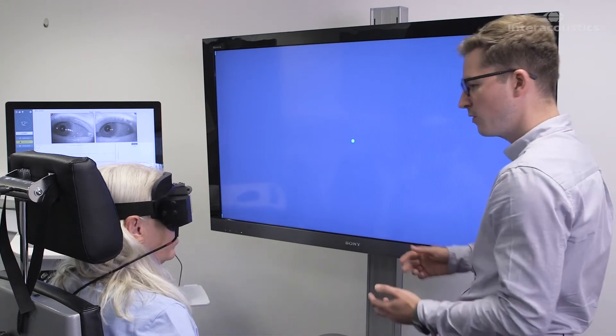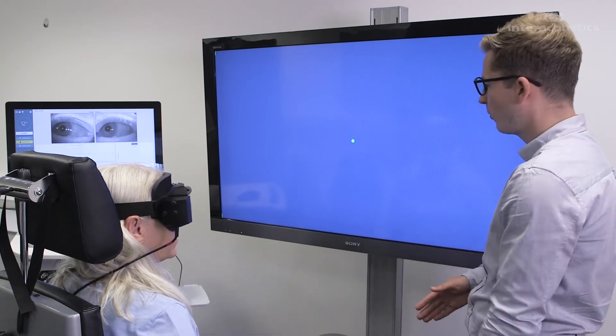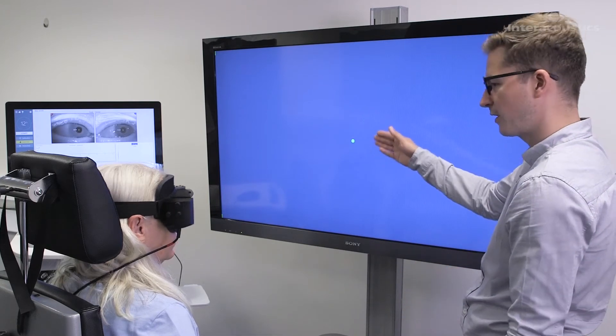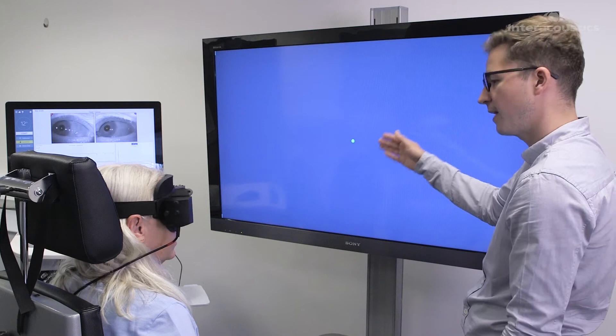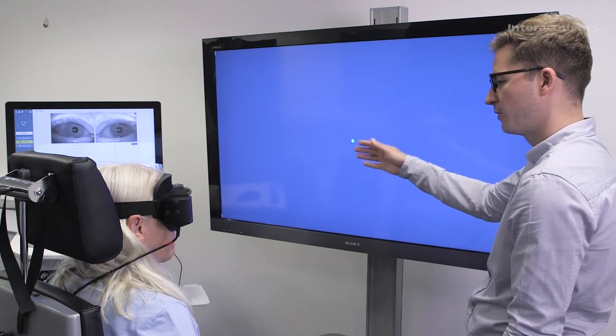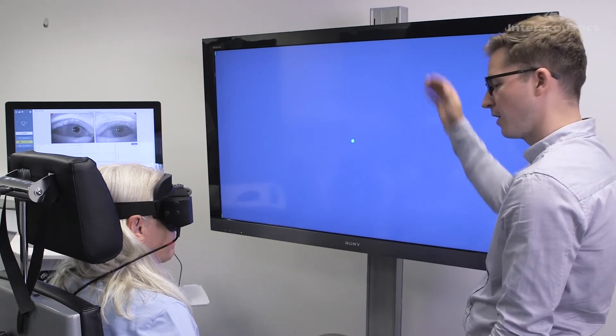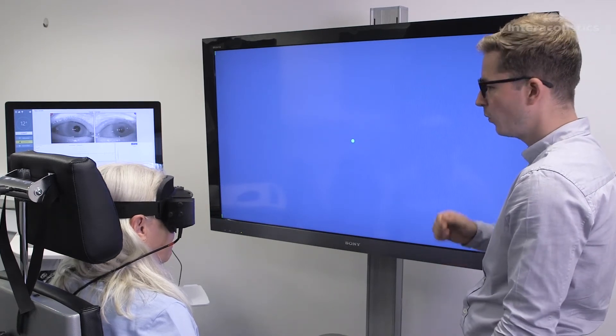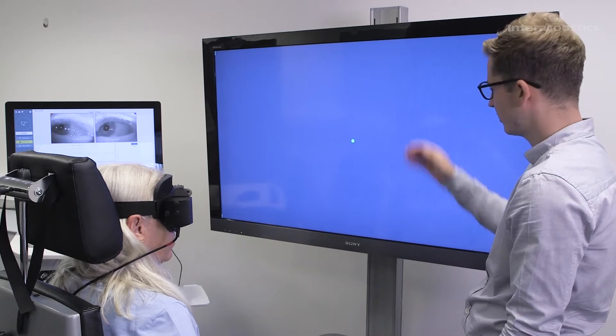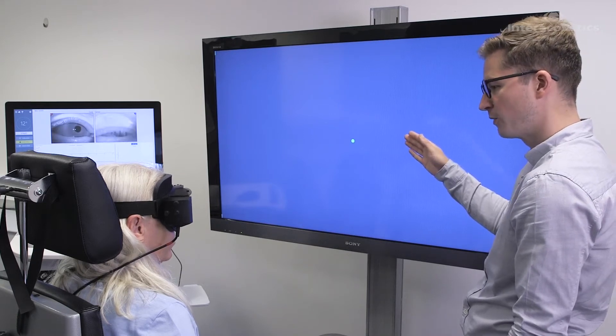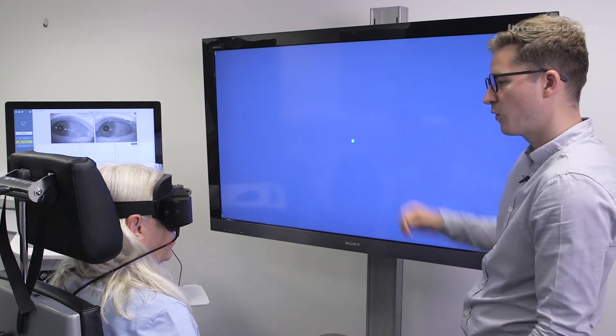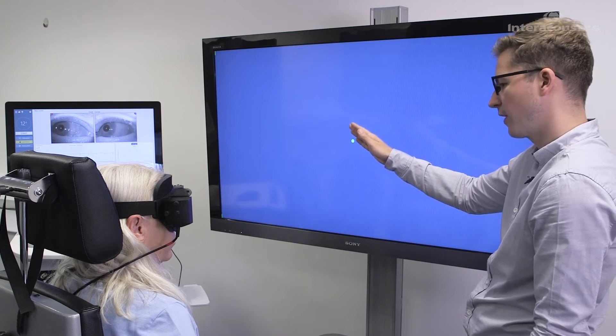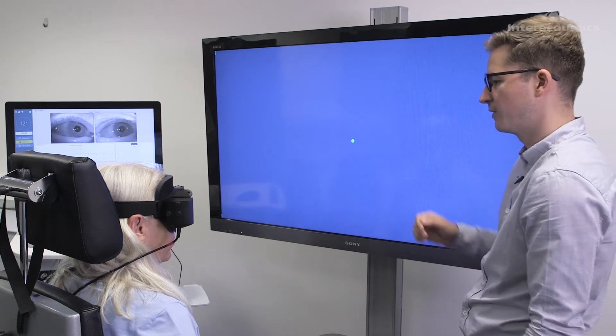During this test, I'm going to ask you to look at the target on the screen. That target is going to move leftwards, rightwards, upwards and downwards. All you need to do is, as soon as the target moves, follow up with your eyes and keep looking at that target whilst it's in that position.